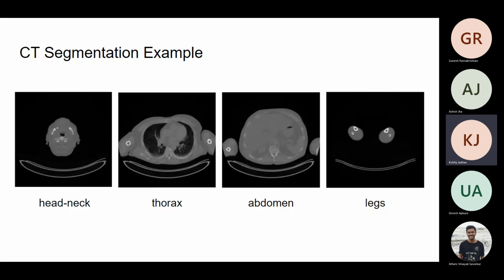It's a very good question from Dr. Ashish. The only thing is the organ detection code works after we have segments. We can't run the same organ detection code for the thorax as well as the head and neck. We need different codes for each segment. From that perspective, I believe we are going in the right direction, because that will help us identify which organ is benign, or which organ is having more SUV, and that organ we can exclude if we opt for this kind of option.